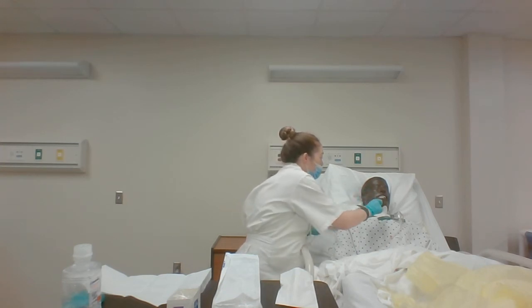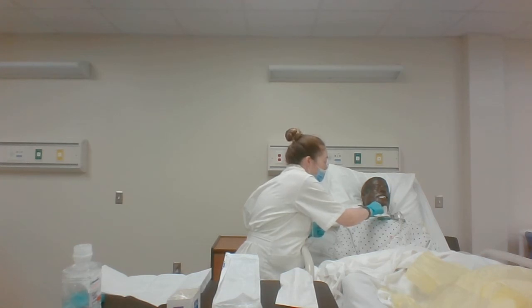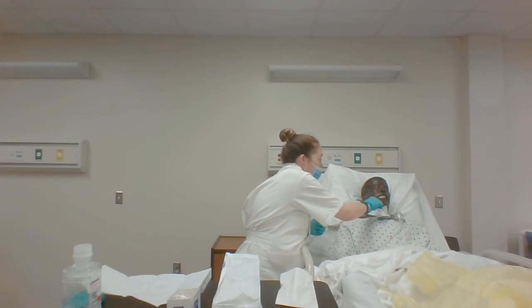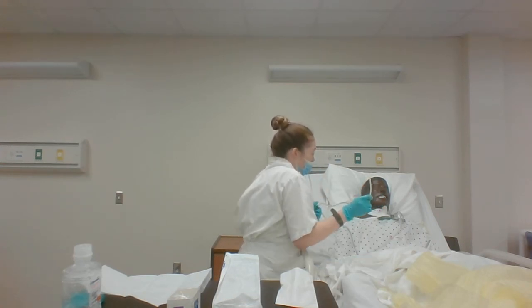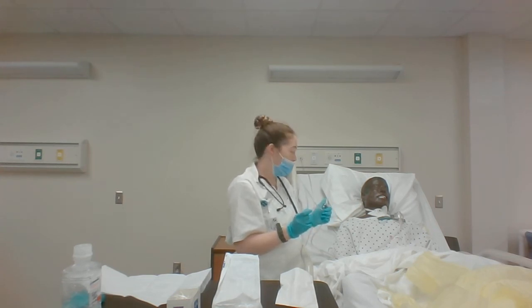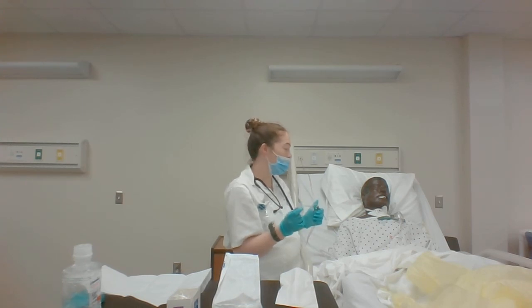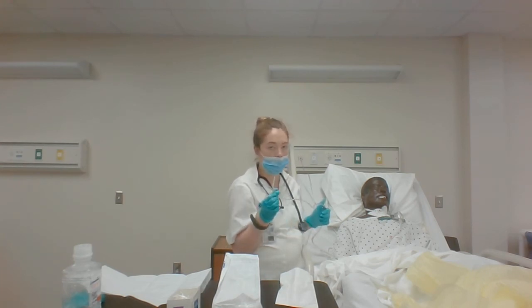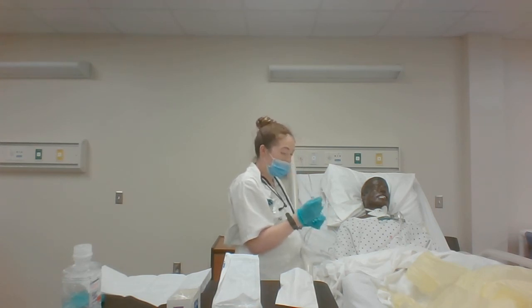I'm going to place my catheter into my trach at least five inches, or until the patient coughs. I will not suction on the way down, but will apply intermittent suction and swirl it between my thumb and forefinger for no more than 10 seconds. I would then use my non-dominant hand to auscultate the patient's lung sounds and assess for secretions. If the patient needed another pass, I would wait one minute and do no more than two passes with the same catheter, then discard it.